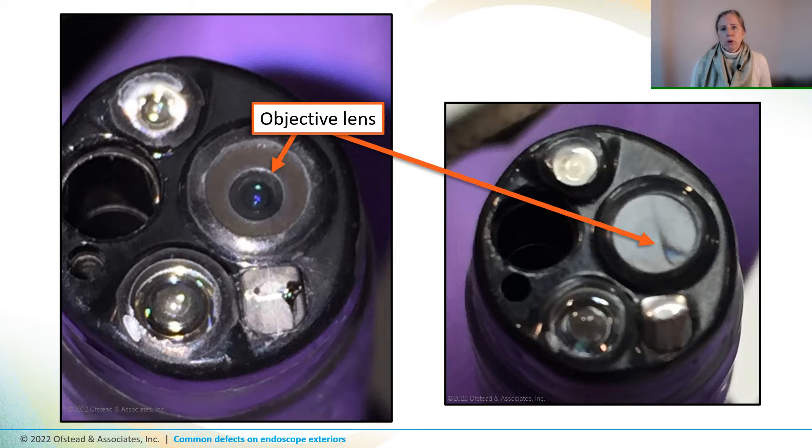Just as a touch point, the adhesive is still there around the edges of those light guides, but it's not as noticeable. Now just for fun, take another look at the image on the left — now that you know it's there, can you see the cracked lens? It's right here.